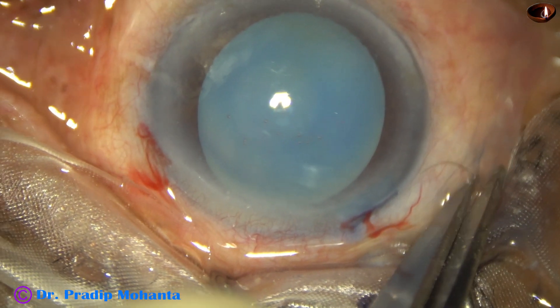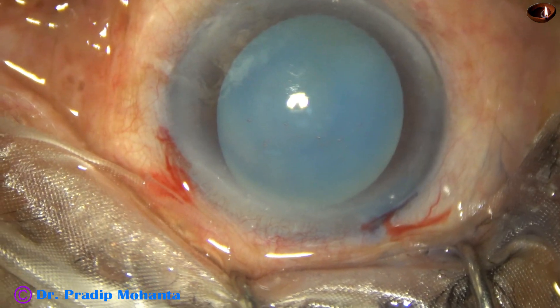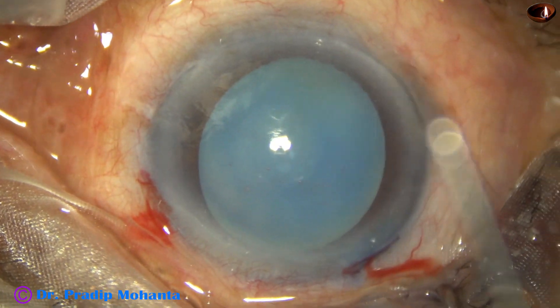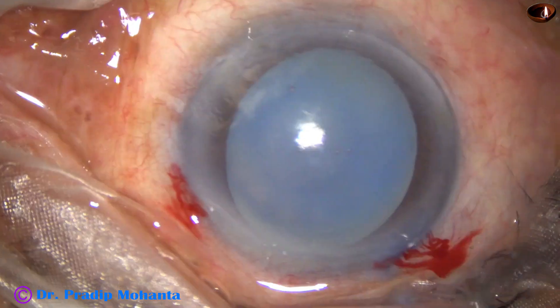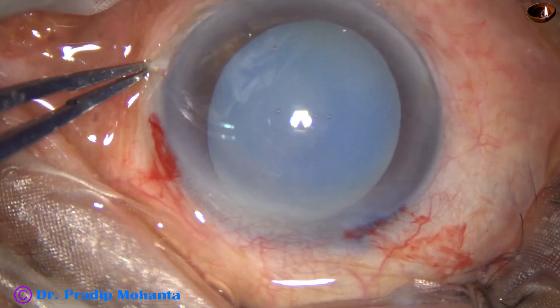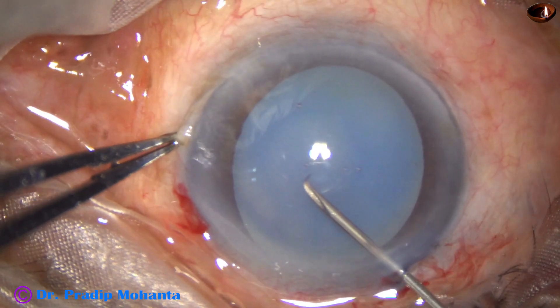This is an eyelash which is trimmed. The rest of the eyelashes are covered by the drape, and now the anterior capsule is incised by this cystotome.